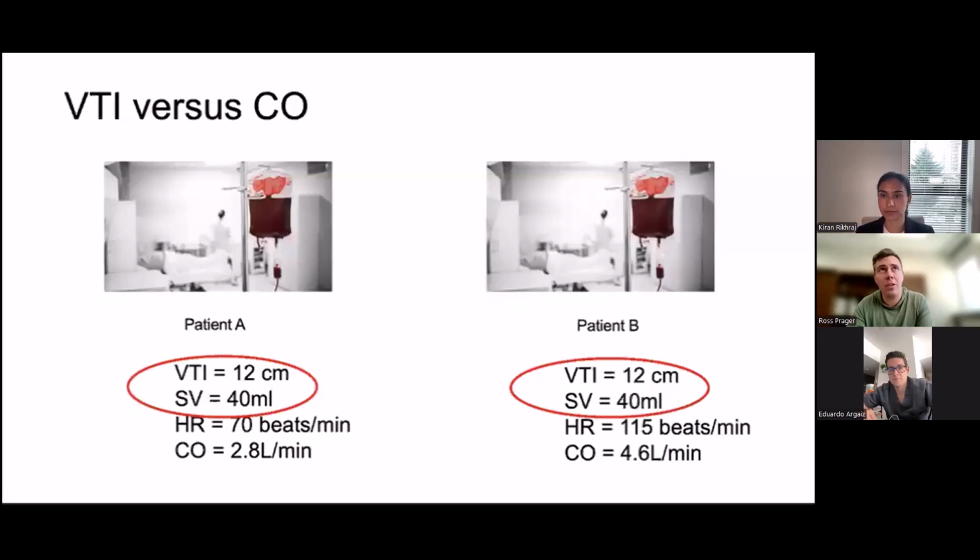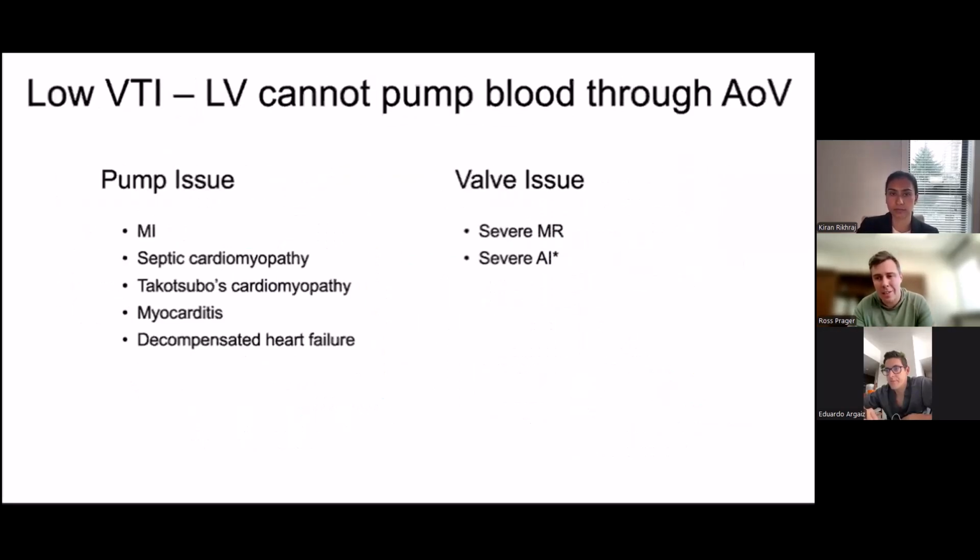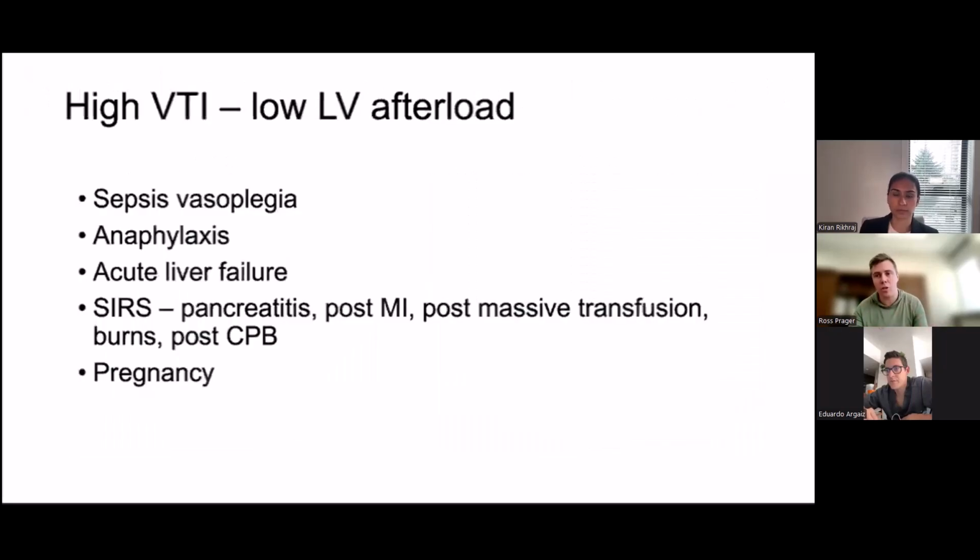Now, if you have a patient that has distributive shock and has a high minute VTI, it also helps dictate your treatment a little bit. I typically don't give a lot of fluids to patients who already have a high VTI, because the purpose of giving fluids is to augment your VTI, to make it go higher. But if your minute VTI is already high, what are we going to accomplish by increasing that stroke volume even further? And so often on those patients, I might even take an approach to use vasopressors preferentially over fluids in that exact population. And so that's how I use it to break down my initial approach to shock.